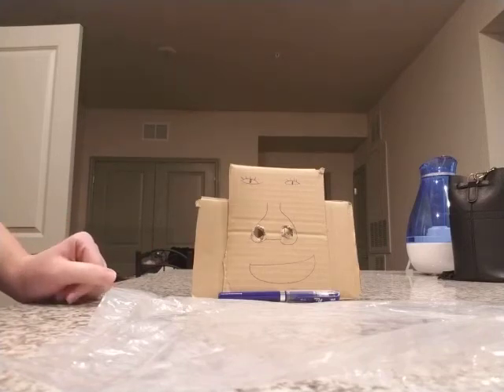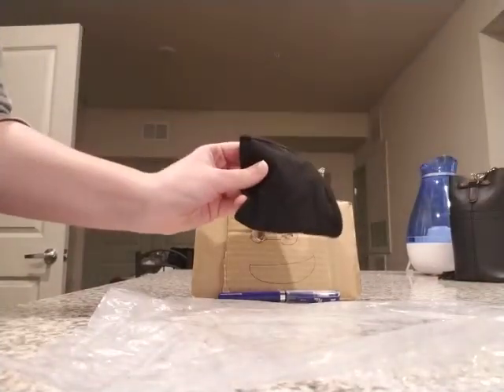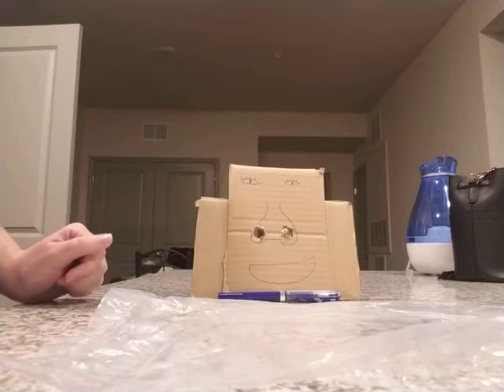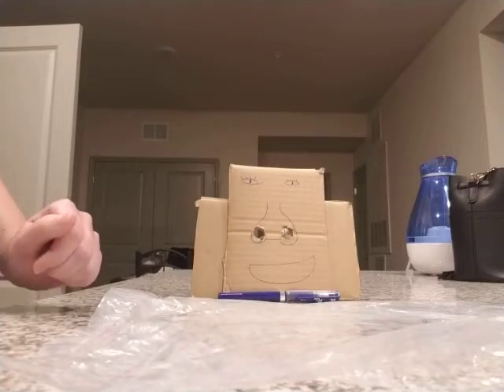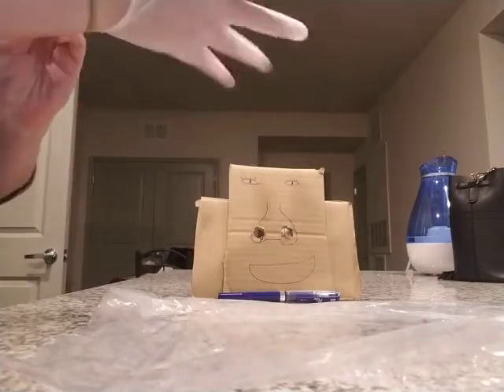I would assess their ability to cough by holding a napkin in front of them and asking them to cough. I would also stick a tongue blade into the back of their throat to assess the gag reflex. And now I'm going to put on clean gloves and prepare my supplies.